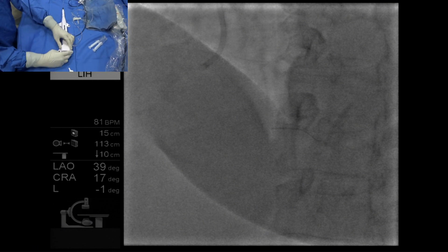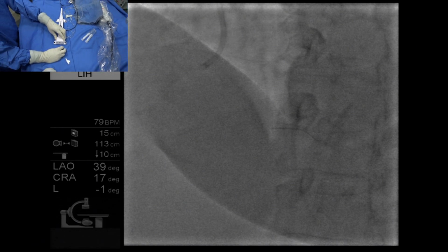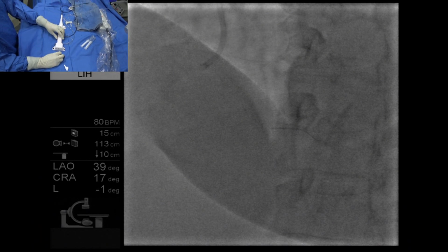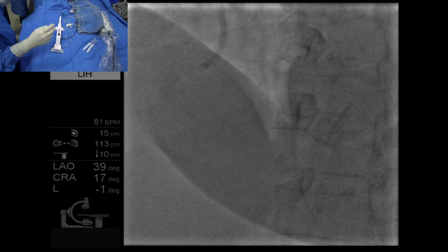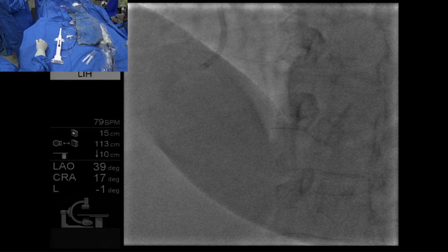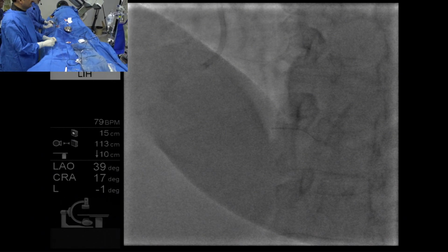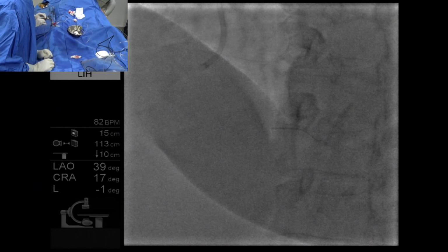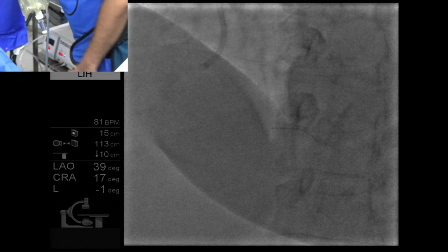Young guys who are not very well versed with rota, we will go step by step, spend some time here. Straight, a little bit more straight. Okay. Now lock it. That's it. Dynaglide off. Let us check the speed. Set it at 150,000. Perfect. Okay, Dynaglide on.